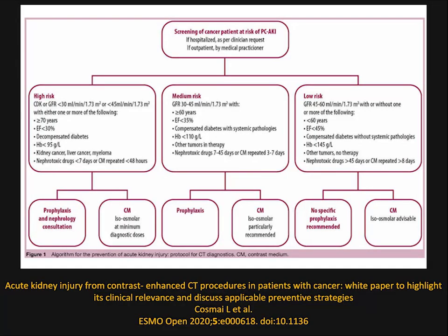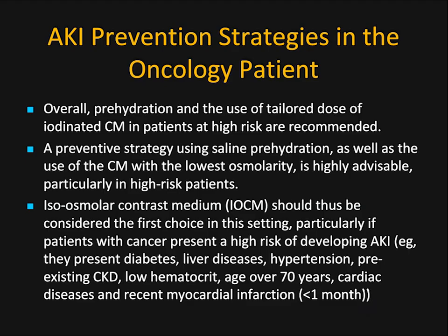And again, they go through some of the different strategies of what you can do depending on high, medium, or low risk. Looking at those charts, you could see hydration, isoosmolar contrast, and lower volumes. With things like dual energy, we could lower the volume. We all know you need a certain volume of iodine to pick up liver metastasis. That never changes, but obviously, things like 250 cc's are not something we do within CT.